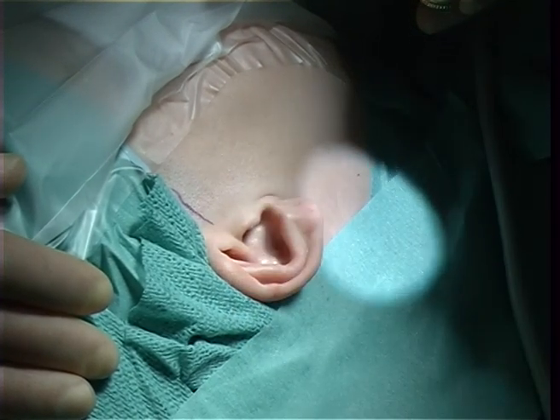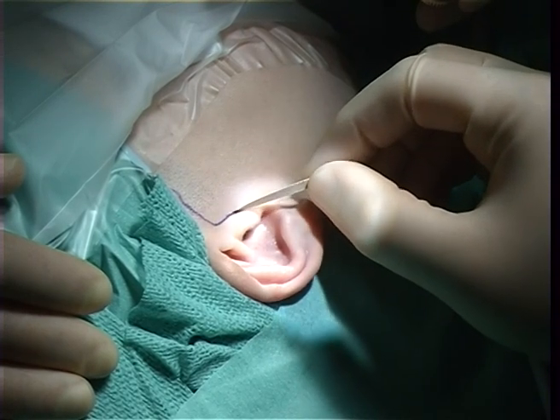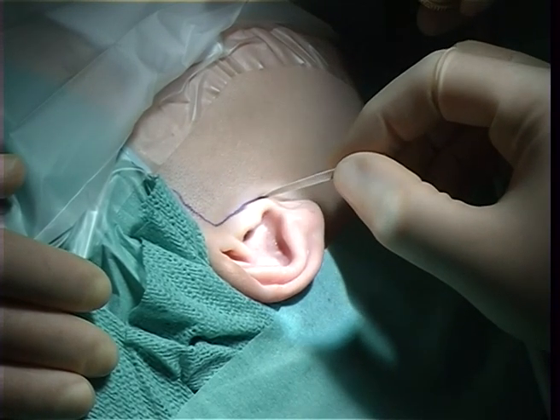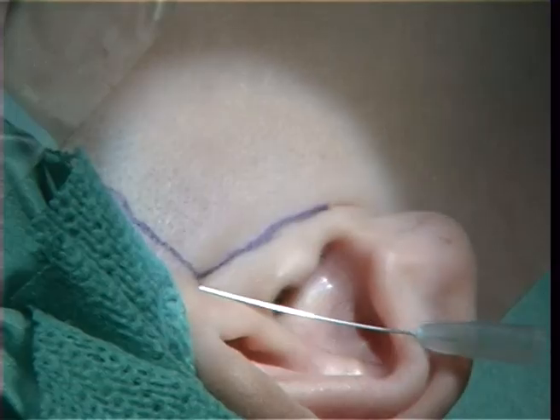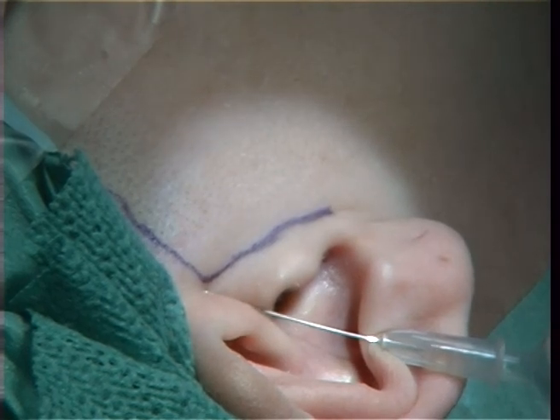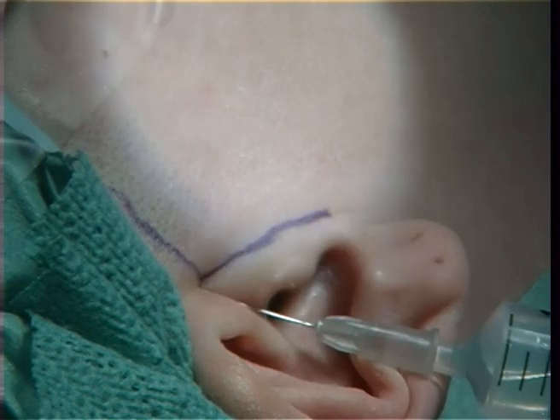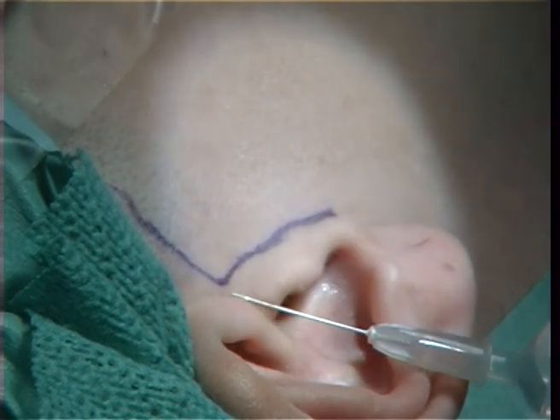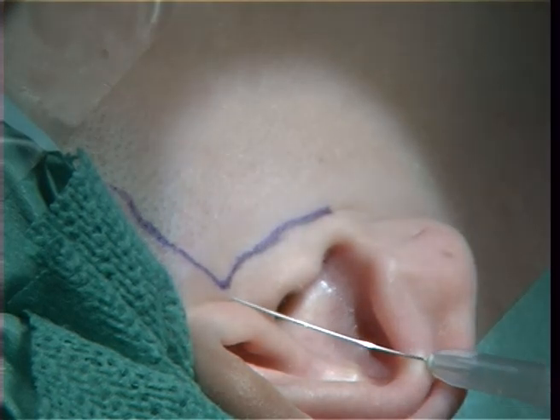You can see the incision line marked here. You can follow how we start marking the incision line with ink. This makes it easier when you go there with a knife. This is done to avoid coming into conflict with the facial nerve.